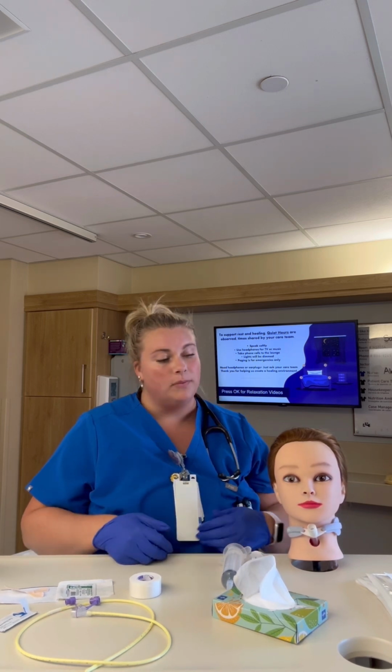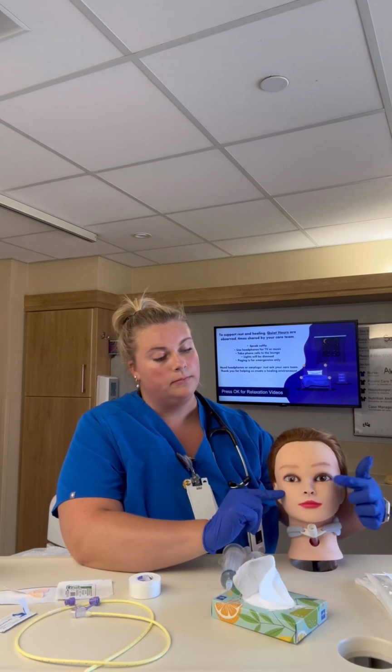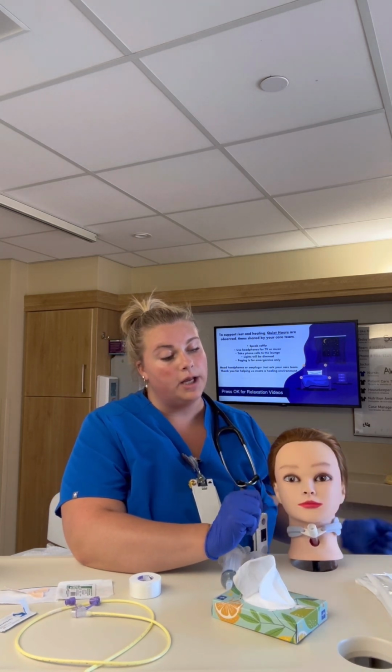For the next step, we're going to ask the patient to blow out each of their nostrils to see which one might have an easier passage for the NG tube. Mrs. Smith, can you please blow out each nostril? Good. Today we're going to be inserting the NG tube in the right nostril.